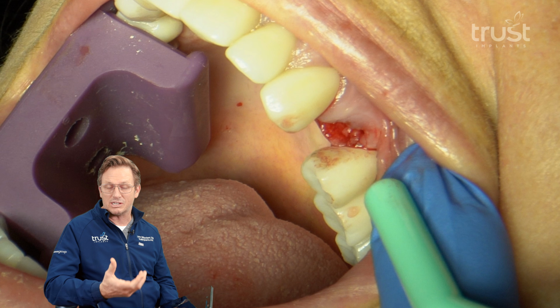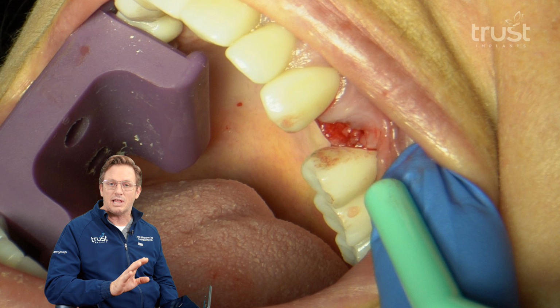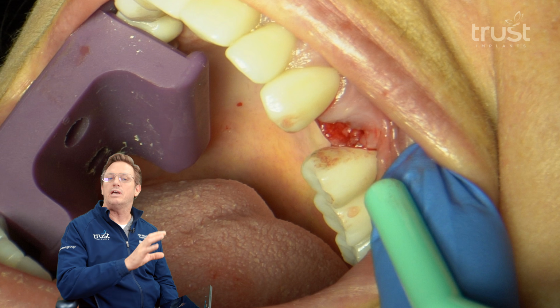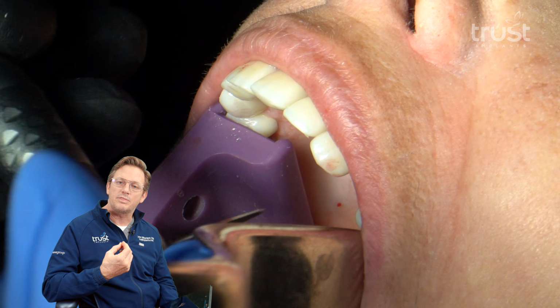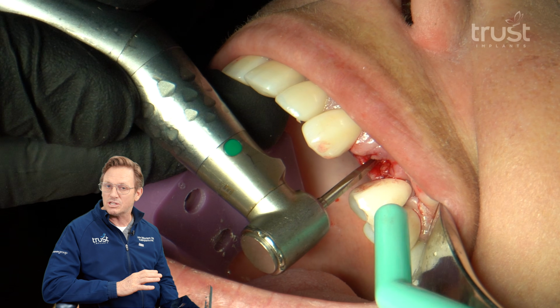So you can see here we've elevated the tooth out, and then I degranulate or clean up the extraction site. I haven't touched the tissue. I've not raised a flap. I have not used a scalpel at all, because I want to preserve the architecture of the tissue and the architecture of the bone. I keep all of these things in mind as I am thinking about the initial preparation of the osteotomy.